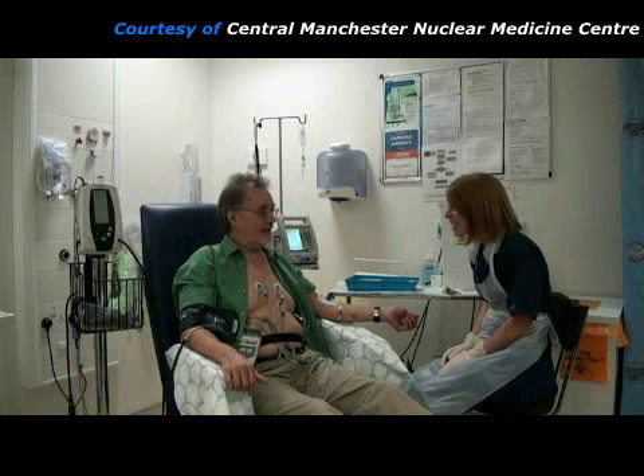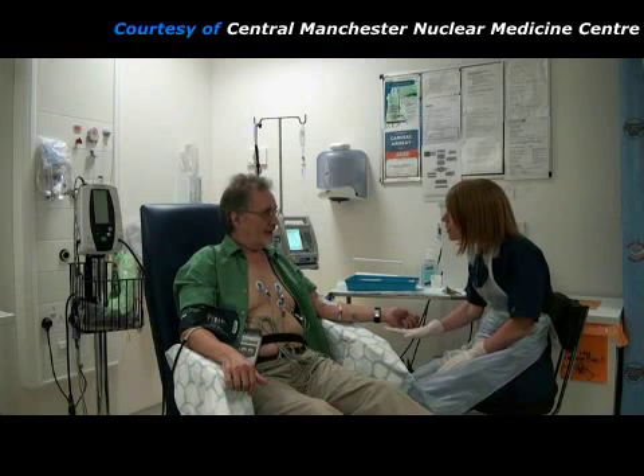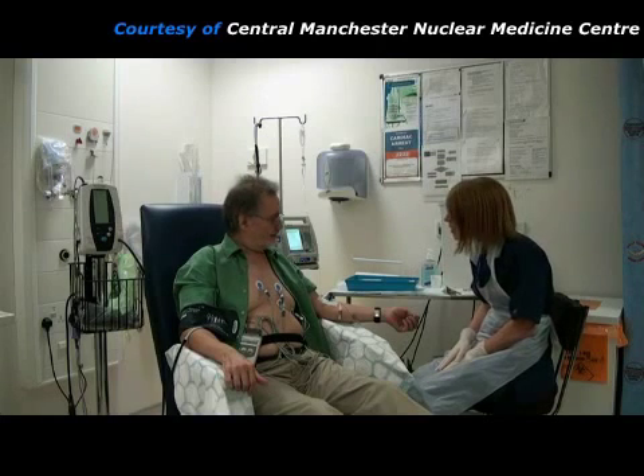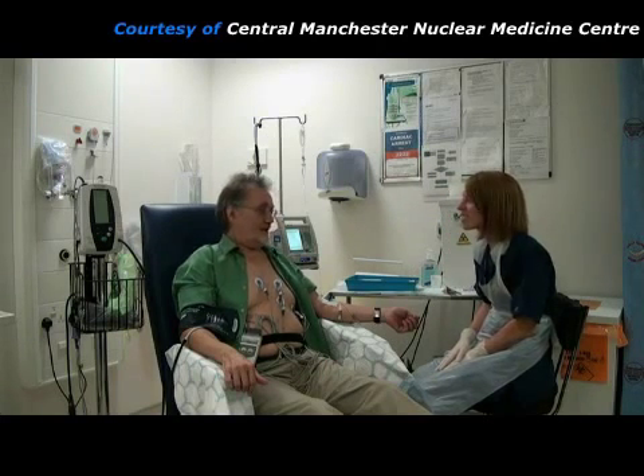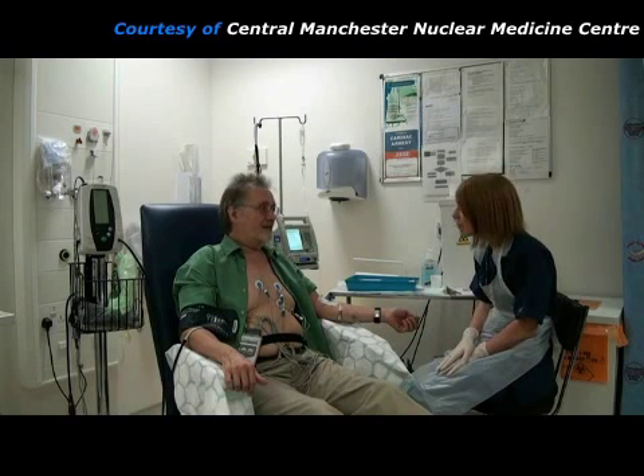Alternatively, if the patient is not able to pedal on the bicycle, they can simply sit in the chair whilst a drug is infused through the needle in their arm. This is known as pharmacological stress. Several different drugs may be used, but they all make the heart beat faster or harder, or increase myocardial blood flow to simulate the effect of exercise.